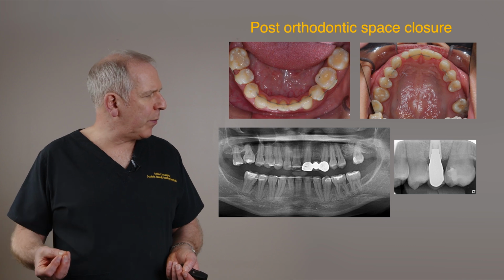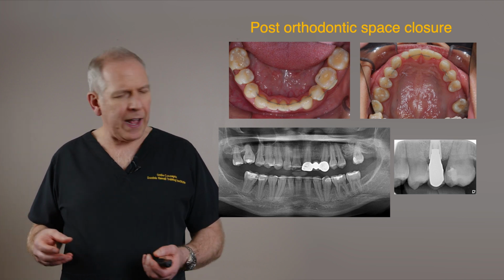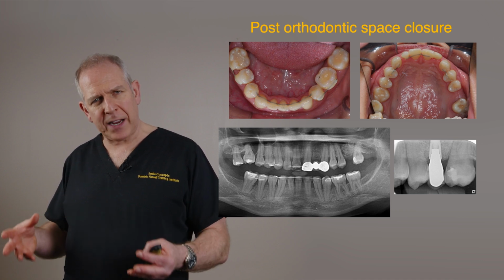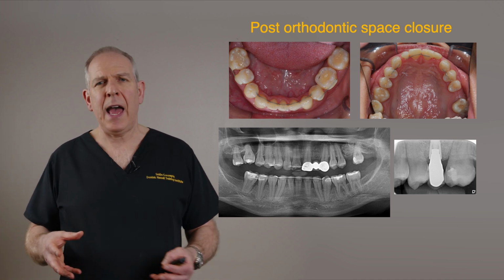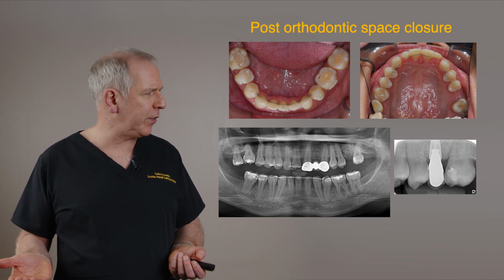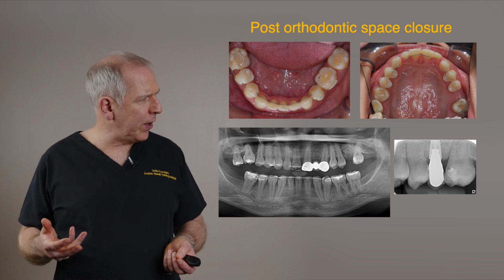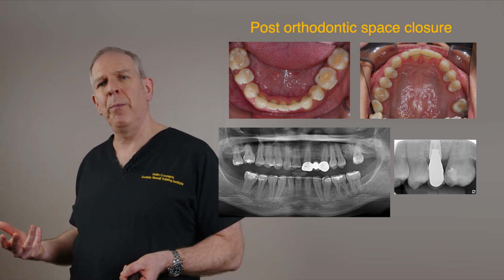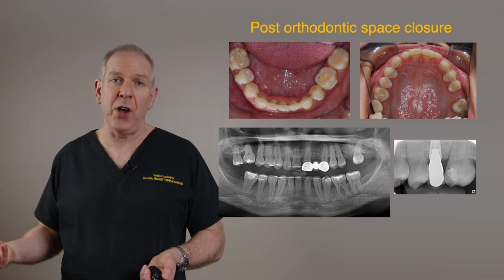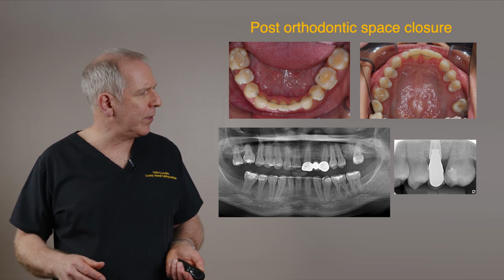Then what else can we see that we've done? You can see from the OPG that we've actually restored the lateral incisor from a peg shape to a full-size lateral. Now, cleverly, what we'd liaised with the orthodontist to do was leave some spacing, as you remember from the last slide. So this could either be done in ceramic or we could do it in composite. And in this case, we did it with ceramic because all of the tooth prep had already been done for basically a 360 veneer to go on that tooth.